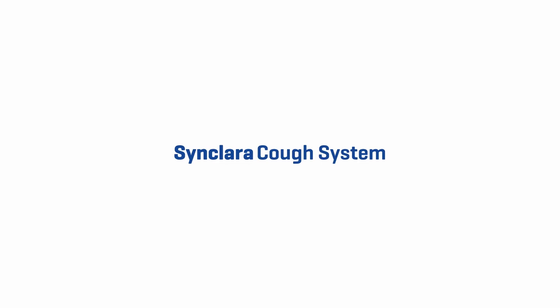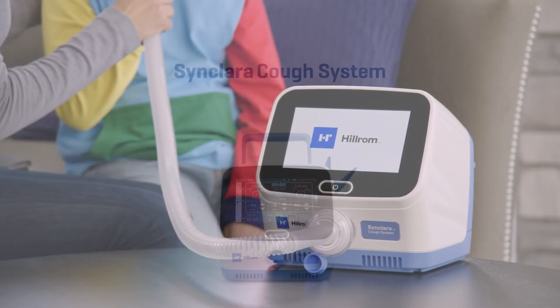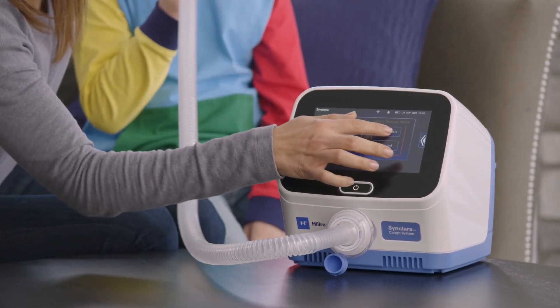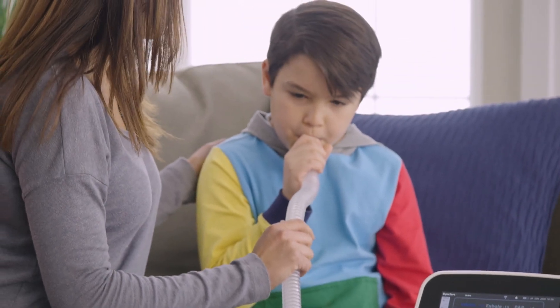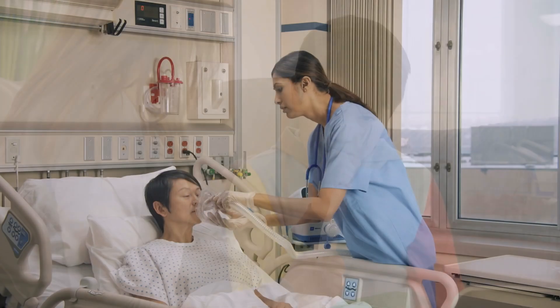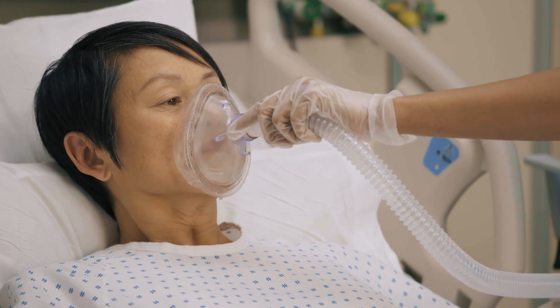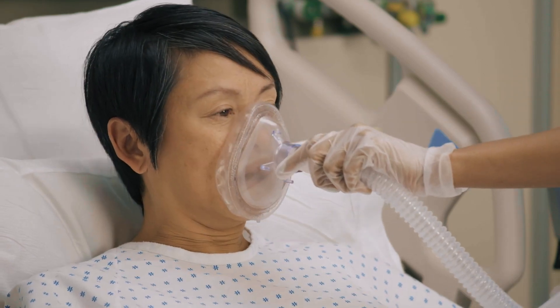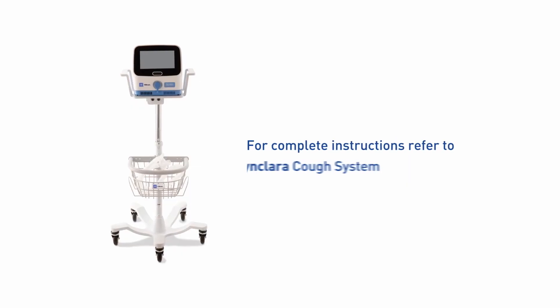The Synclara Cough System, part of a gold-standard family of airway clearance products, is designed for use by patients, caregivers, and healthcare providers to provide non-invasive therapy that is a safe alternative to invasive suctioning. Developed with patient comfort, flexibility, and safety in mind, it simulates a cough to remove secretions in patients with a compromised peak cough flow. This video will provide an overview of the system features and instructions for use; for complete instructions, refer to the Synclara Cough System User Manual.